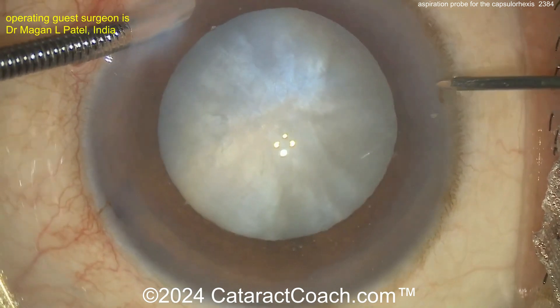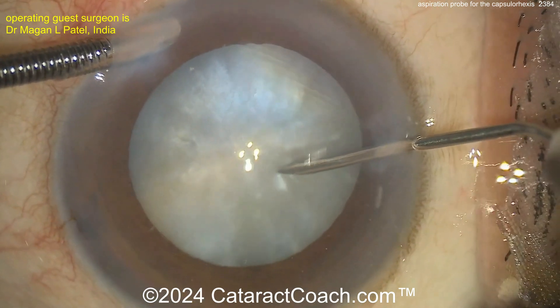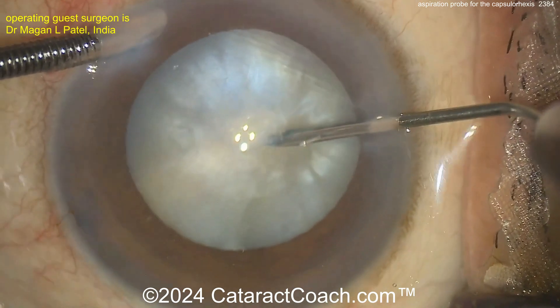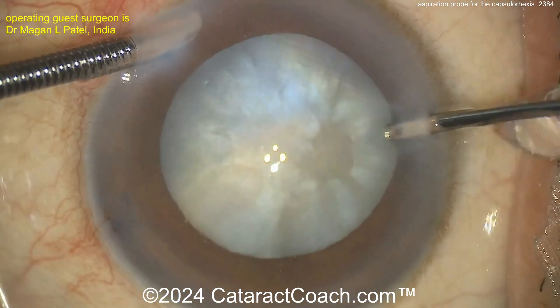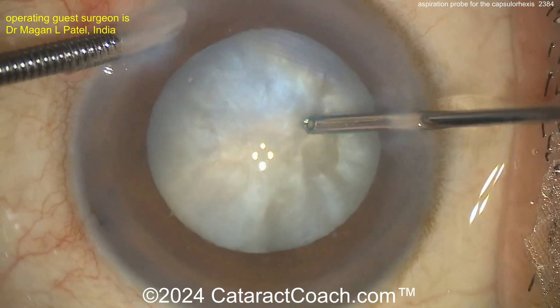Here's a new case. Same thing here — AC maintainer. Going in with a needle to poke into the lens capsule and aspirate, so phacoaspiration or needle aspiration of the lens material. Remember to rock it back and forth. This is a liquefied lens cortex in front of the nucleus, but also behind it. Once that is done, using the aspirator to go underneath the anterior lens capsule.